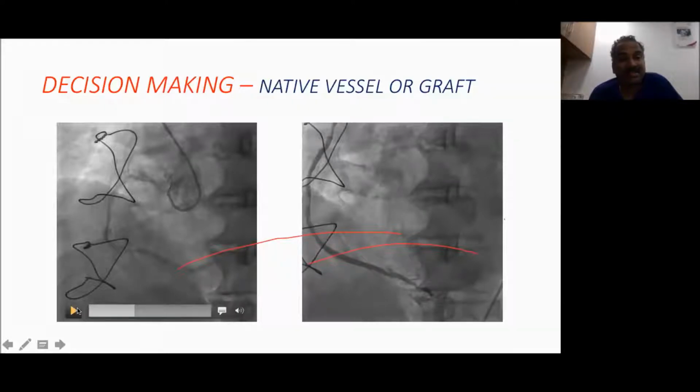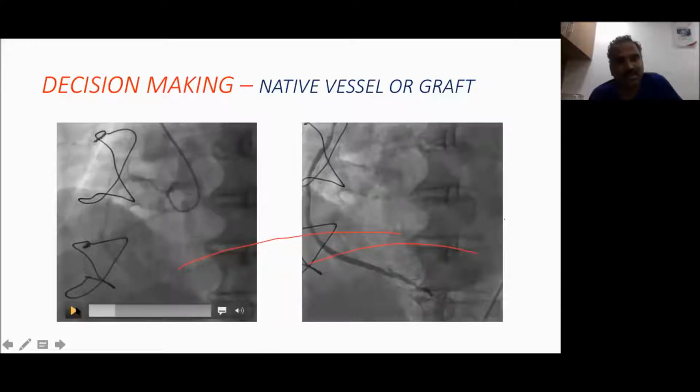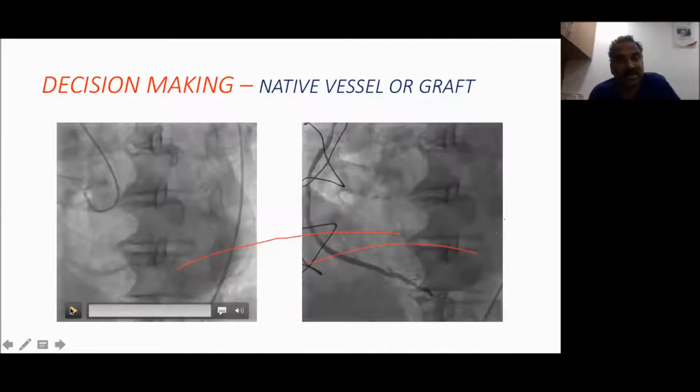But in this case, it is a very calcified lesion. I don't know whether you are able to appreciate, you can see the vessel even without contrast. So the mobile calcium, it is very calcified and the lesions are long. I don't know how many stents he needs minimum. So he needs rotablation, IVUS, rotablation, and minimum 2 stents, maybe 3, for the RCA. So that's the situation in the RCA, and this is the situation with discrete lesions, though there is some blockage in between in the venous graft.